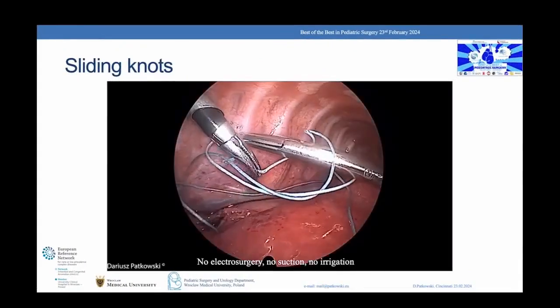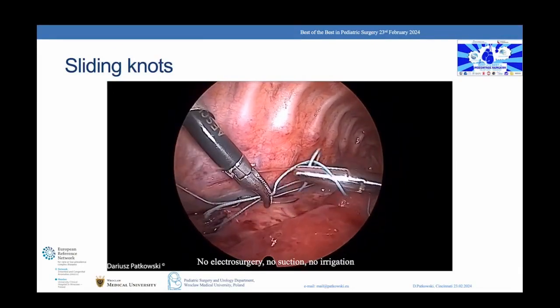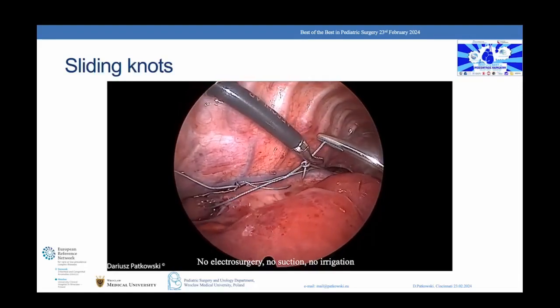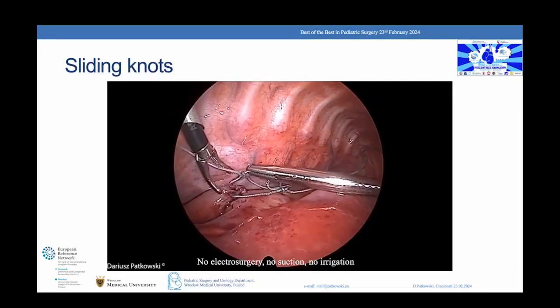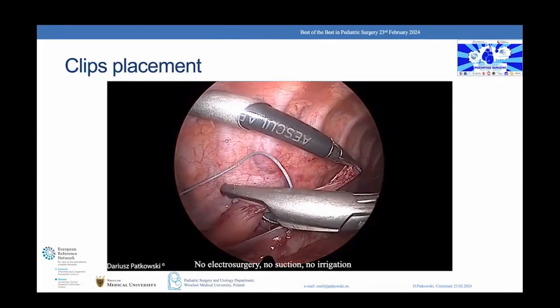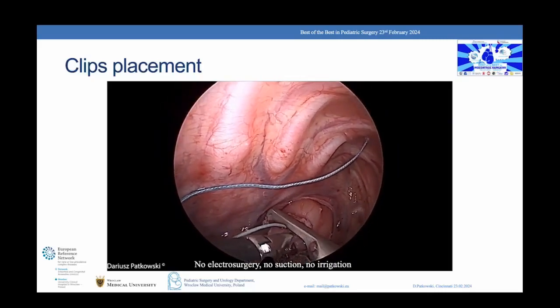The technique of tying a sliding knot in a small space requires a lot of skill and experience. It is one of the bases for success. Two sliding knots are made on both arms of the suture. The clips are placed to cover the entire thickness of the tissue and part of the suture. This method prevents leaks and allows for greater force to be used for traction.